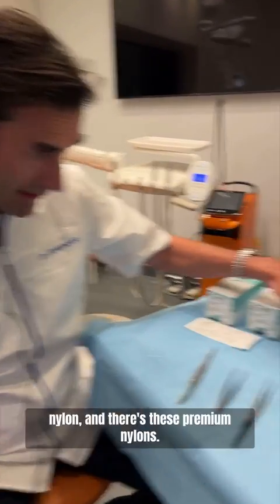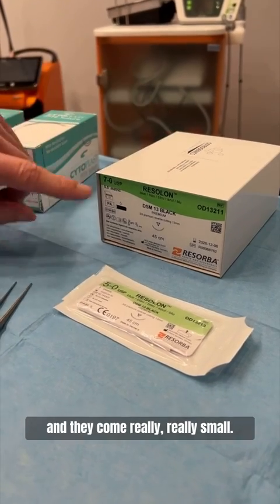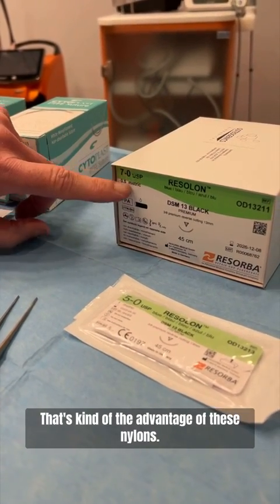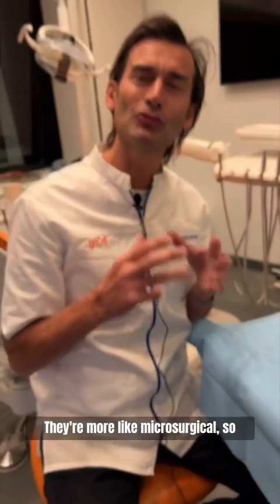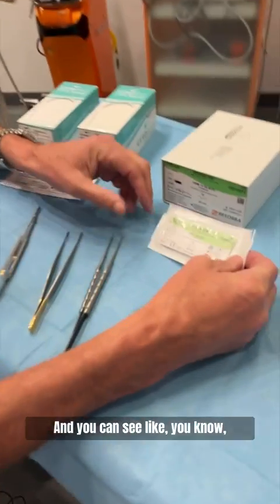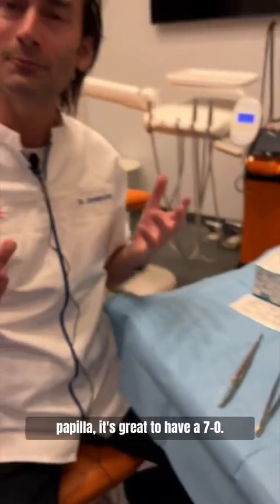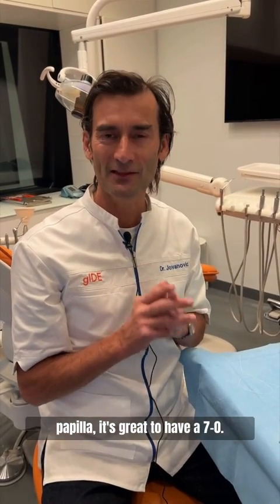Sometimes you can also use nylon. There are these premium nylons — you can see here, Resolon — and they come really, really small, which is kind of the advantage of these nylons. They're more like microsurgical, almost like ophthalmic. You have larger sizes like 5-0, but especially when you have a thin papilla, it's great to have a 7-0.